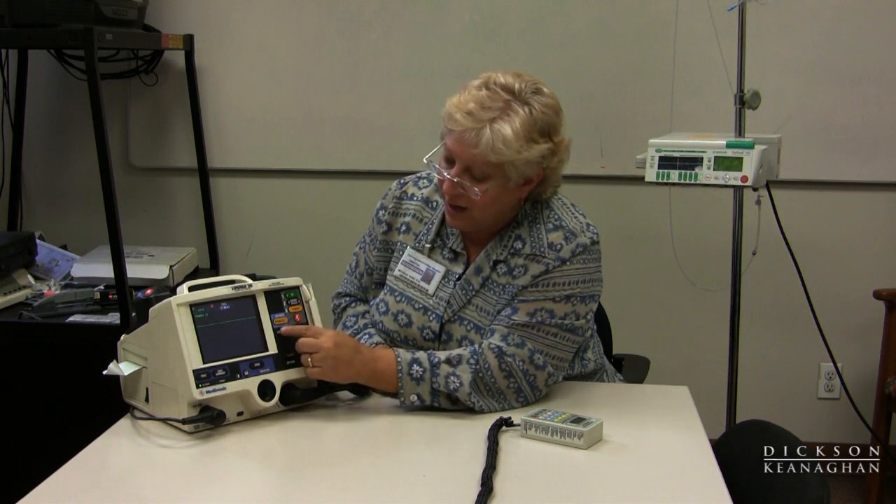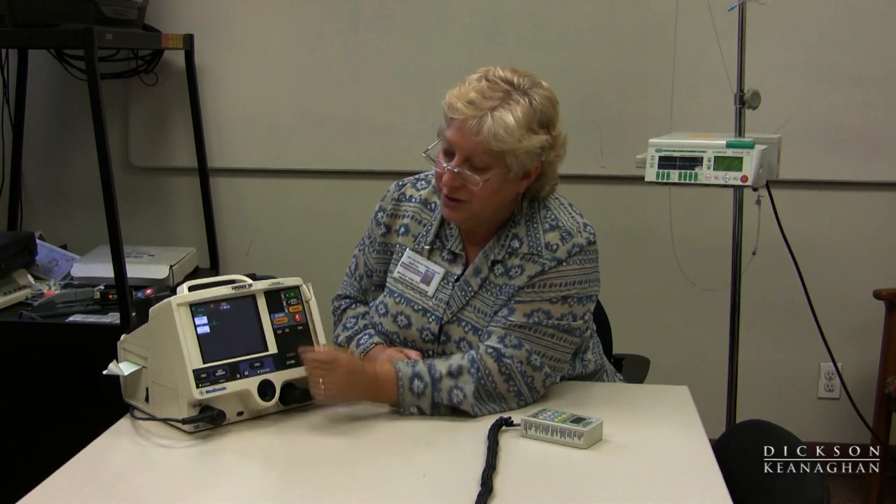Paddles and pads are the same mode, so it's looking for pads or a paddle. If I have the EKG leads on the patient, which I do now, I will put it in lead two. Lead two is the best lead to use because it gives you the best upright picture, enabling you to see the P, Q, R, S, and T waves much clearer than any other lead.